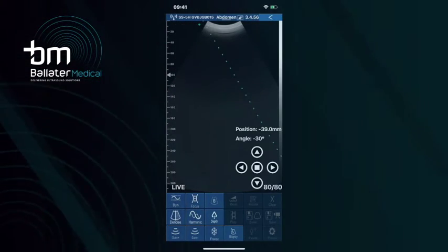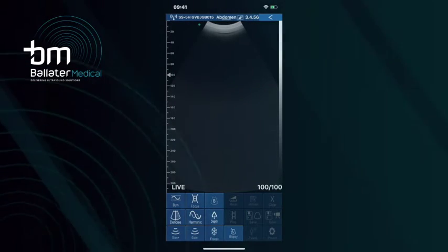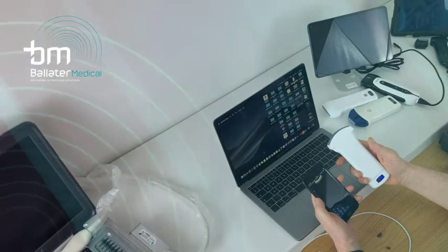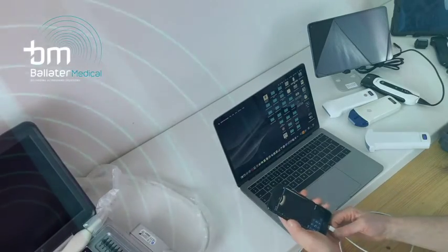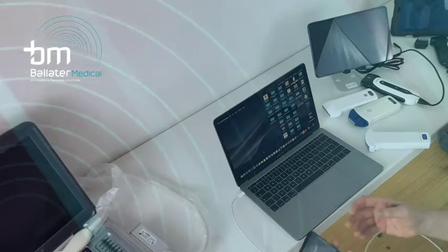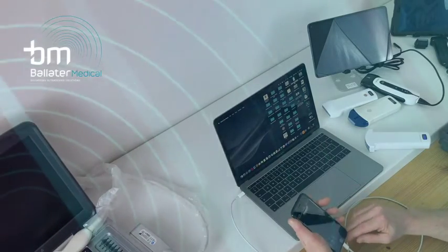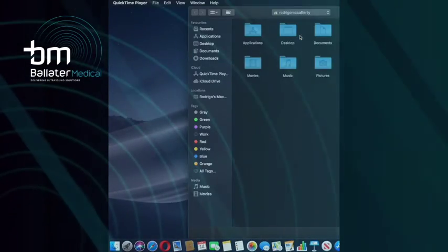So now having wirelessly connected to your phone and ready to scan, the next stage will be setting up for screen mirroring on your laptop. A number of online meetings platforms have an inbuilt screen sharing facility. However, I'll show you how to use a standalone QuickTime screen share for those platforms that don't have this function. A wired connection between your iPhone and laptop is recommended. Connect your phone via the mini USB cable, and then use your QuickTime Player application on your laptop to screen mirror.